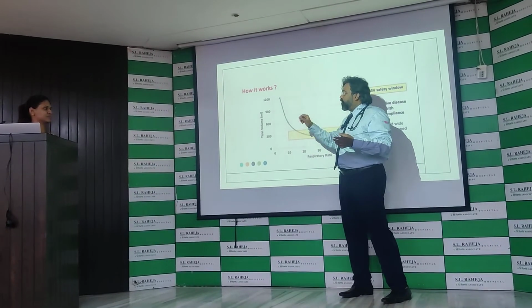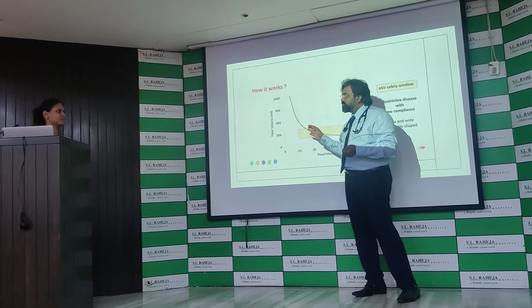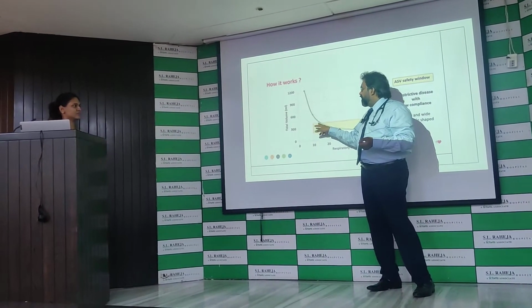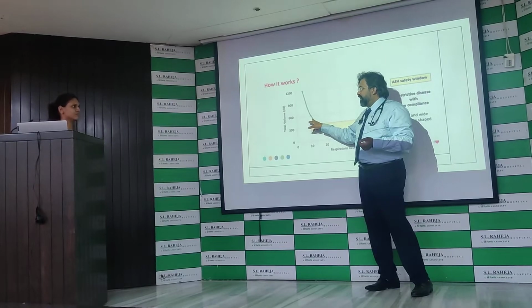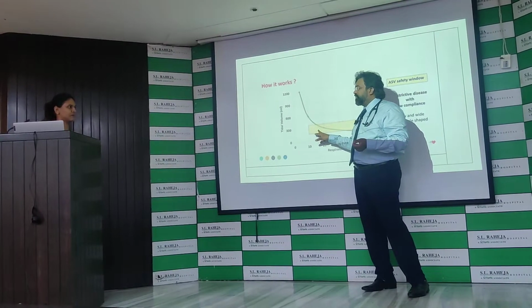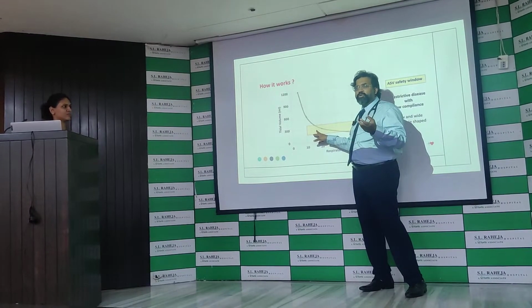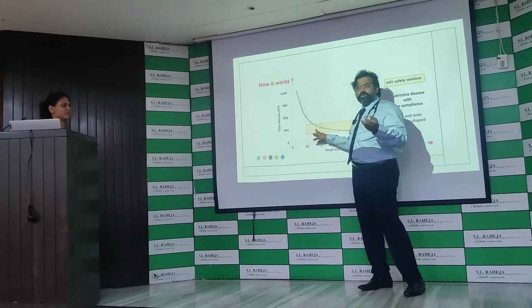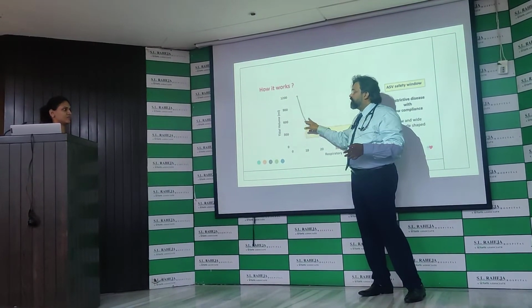Similarly, if you are doing all the adjustments and the compliance has worsened further, and now this has gone out of the window, it will actually try to get it back here by changing the pressures in such a way, because essentially it's pressure control. So it will change the pressures in such a way that you are no longer subjecting this patient to such a high tidal volume.